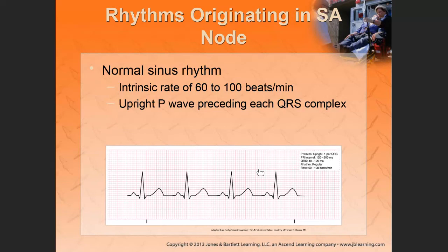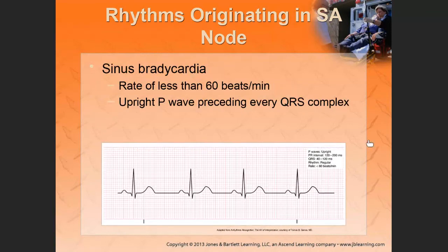This is the mistake that young med students make. They don't want to be seen with the paper because they were taught how to use the paper. Don't want to be seen marking off anything. So they're trying to look at a rhythm to determine if it's regular. Never ever look at the rhythm and say, yeah man, this definitely looks normal or this looks irregular. Get in the habit of marking off the complexes and moving it across the ECG. That's the correct way. That's how you're going to minimize errors.